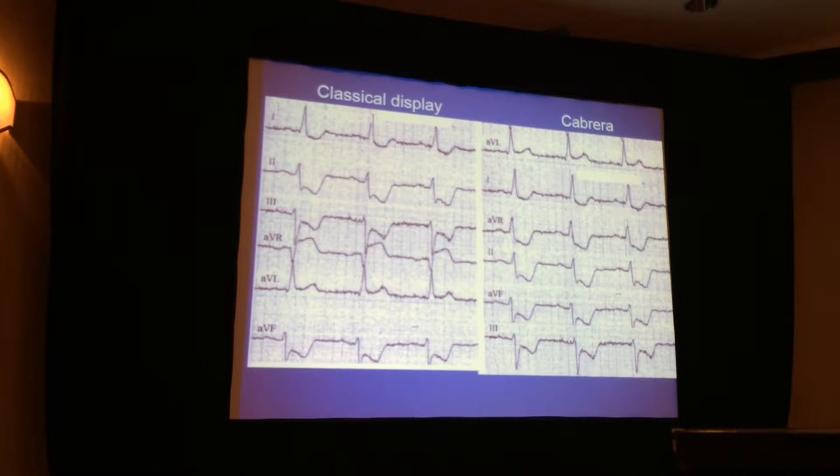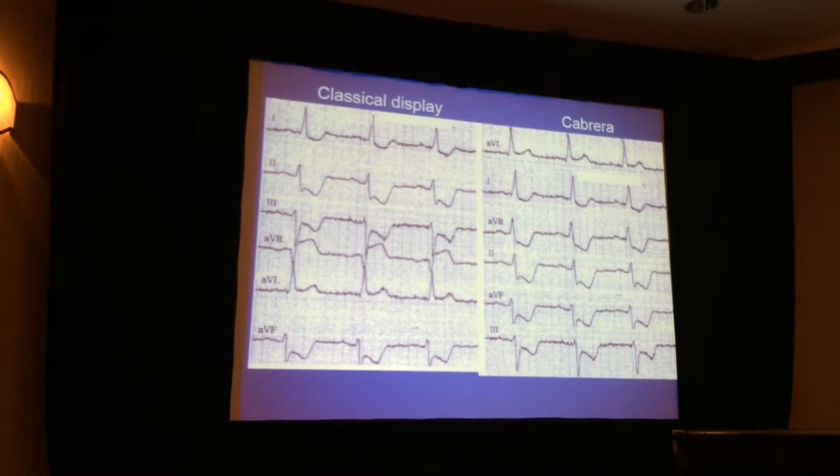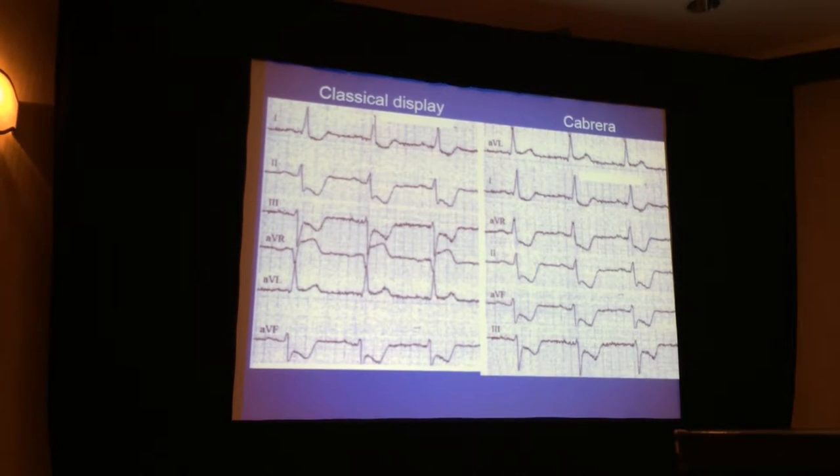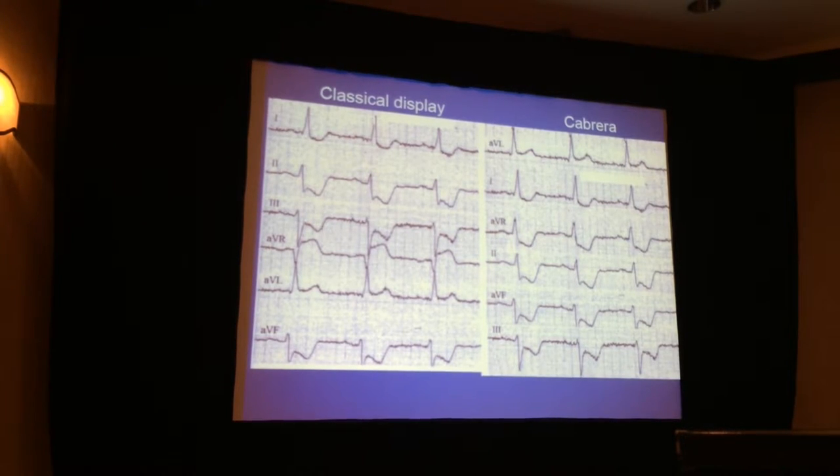Well, one advantage is seen on this slide, because this is a view of a patient who clearly has ST segment changes. When looking at the classical display, you see some ST depression, some ST elevations. If one is asking whether this patient has acute chest pain and an ST elevation myocardial infarction, you can see the only lead with ST elevation is lead aVR. Other leads show a lot of depression. And so this could be described as an EKG with an isolated ST elevation in aVR.